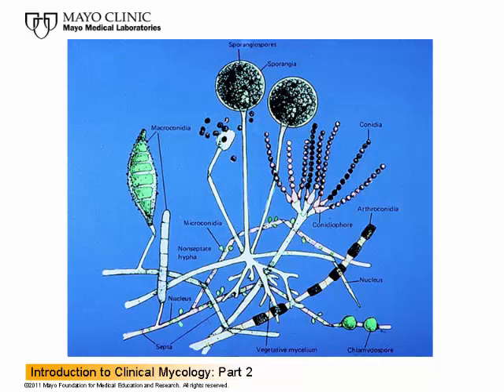These are 2 extreme examples. One is a large spore, one's a small spore. Macroconidia, microconidia. And we use all sorts of terms. For the Zygomycetes, we use the sporangium, that is the structure that produces the spores. If you notice the one that looks like the fingers on a hand that is branched, that is Penicillium. You notice that the spores are produced in chains at the tip of elaborate structures.